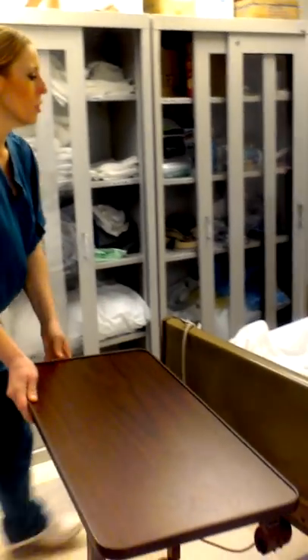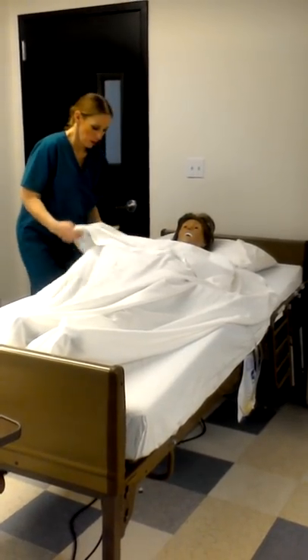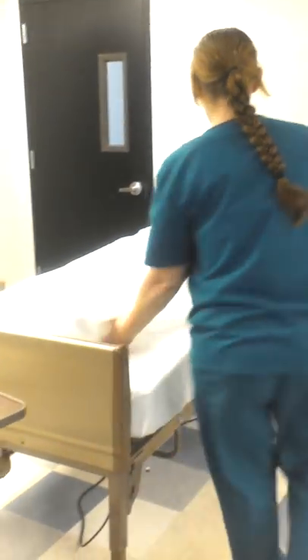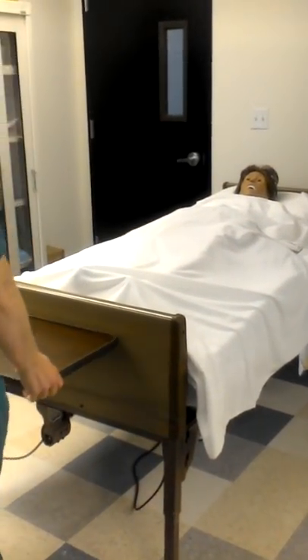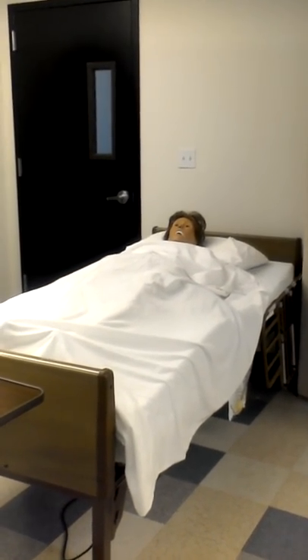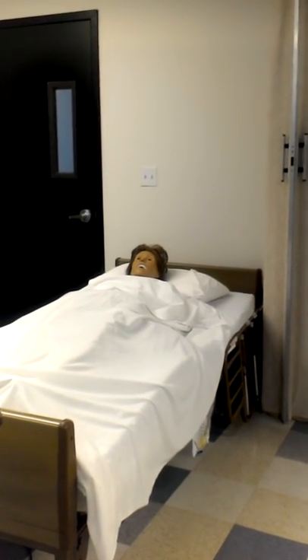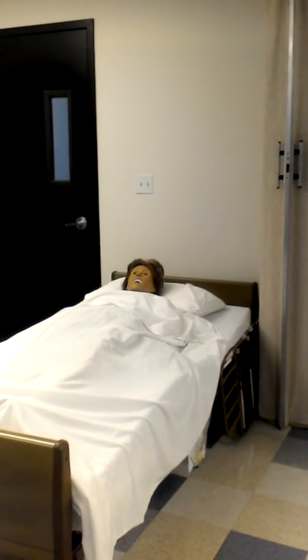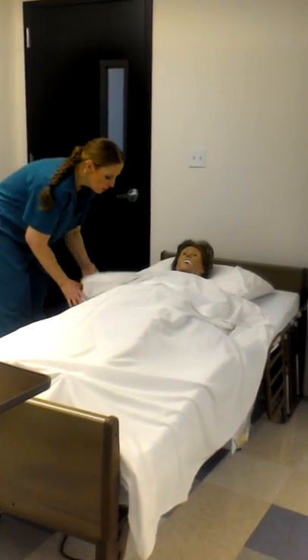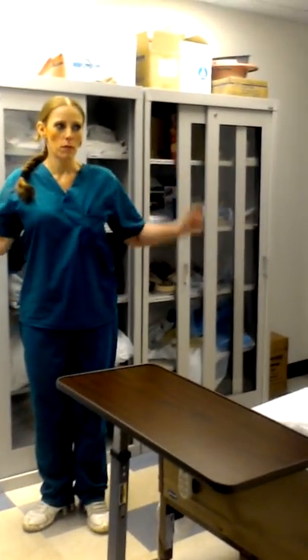Okay, Mrs. Chase, I'm going to straighten the sheets and adjust your pillow. Are you comfortable? Do you need anything? Pull back the screen. Lower your bed. Here is your call light — don't hesitate to ring. Always make sure you place the call light in your hand, even if it's a manikin. Wash my hands. I'm done.